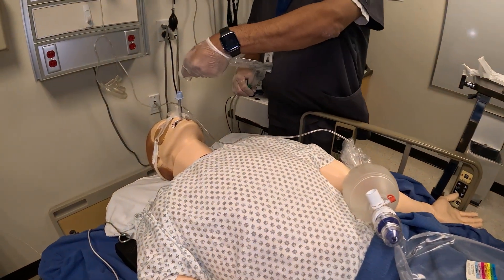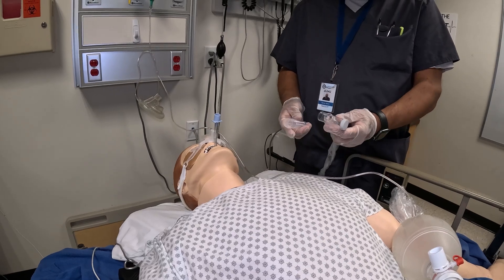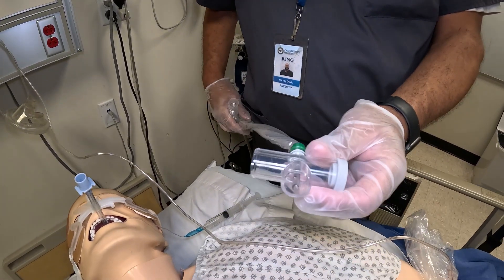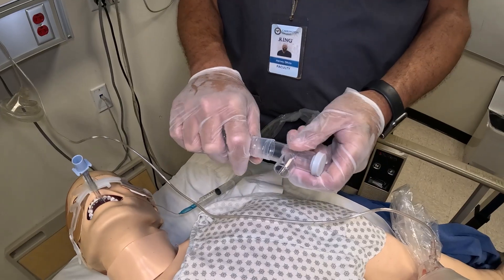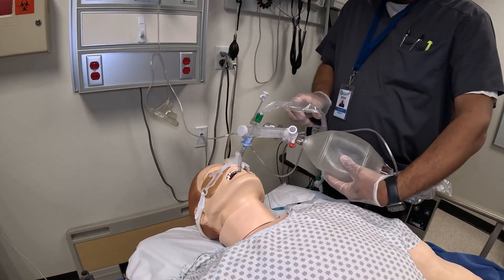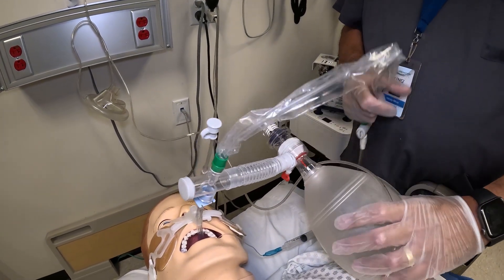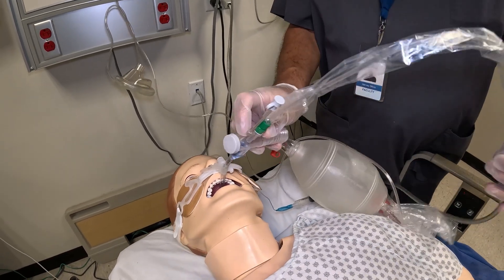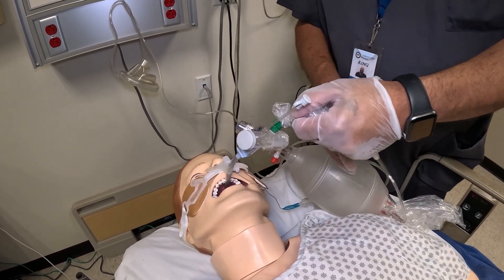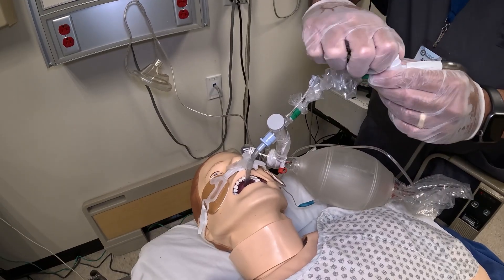This is the part that attaches to my suction, and this is the part that attaches to my ET tube. If you're ever not 100% sure of how to put it together — I've sometimes seen people put it together wrong — just remember that the Ballard is going to go through the ET tube, so that should help you know which way it needs to go. You can also attach your ambu bag to this so you can ventilate in between suctioning. I can go ahead and give a few breaths. Now I'm going to go ahead and pass my catheter — same thing, go down and stop when you meet resistance, then suction on the way out.